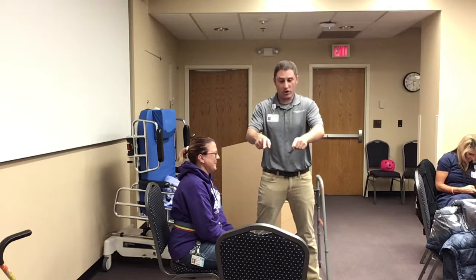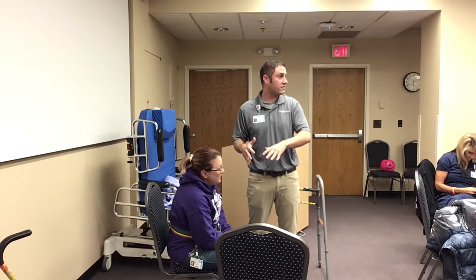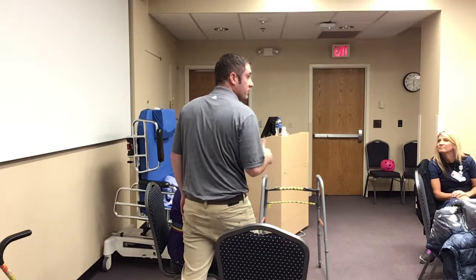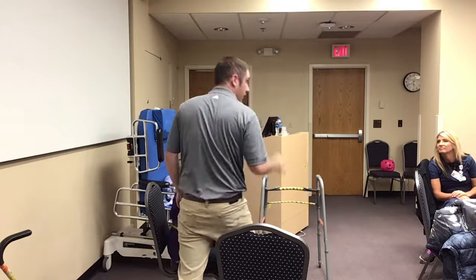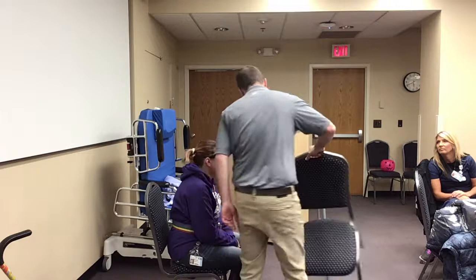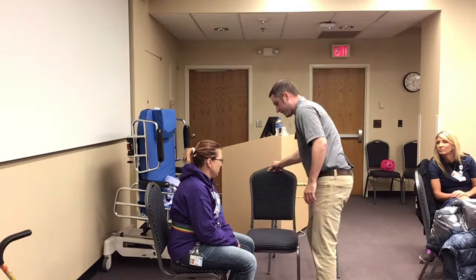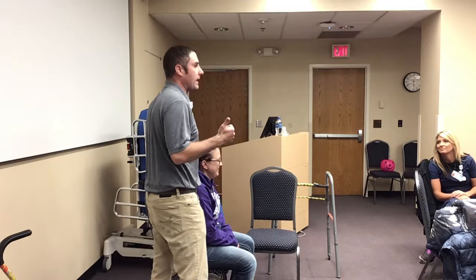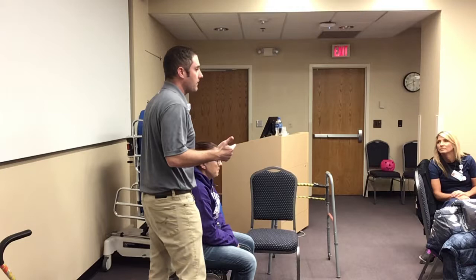We want to go to our right. However, that's her weak side. I need to assist her on her right side because I need to block her right leg when she stands and support her right arm. I can't very well do that if I'm standing over here and the destination is on the other side. Take the extra 10 seconds, unlock the chair, swing it around on the foot of the bed. It's going to save you a ton of time, a ton of work, a ton of energy — just swing that chair around the foot of the bed.